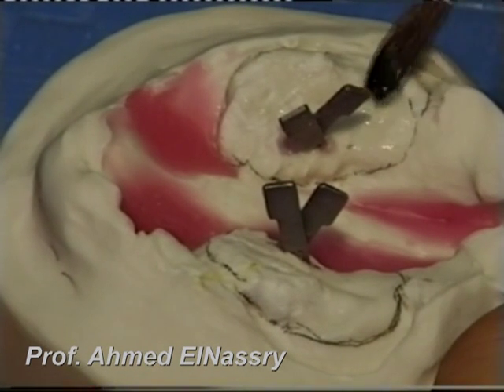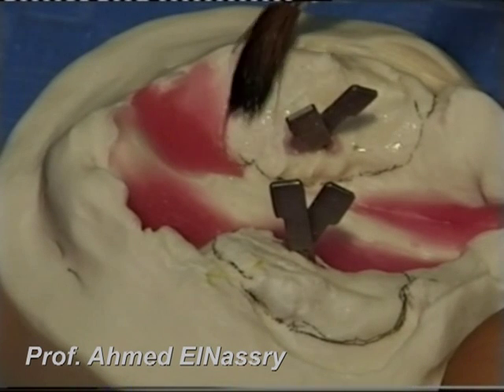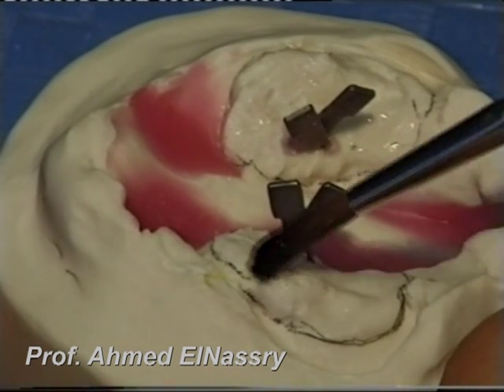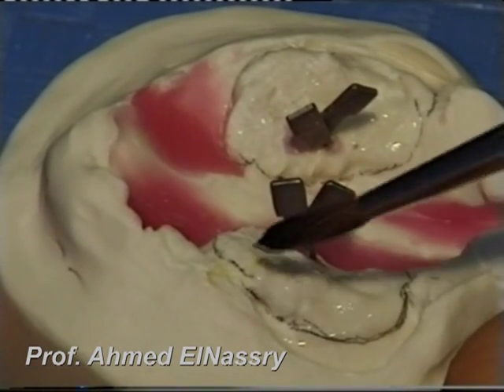The next step is to paint a separating medium over the two maxillary processes to prepare the surface for building up the acrylic parts.